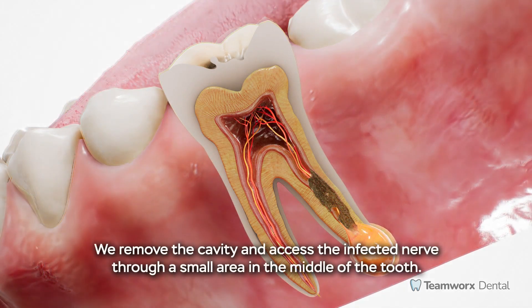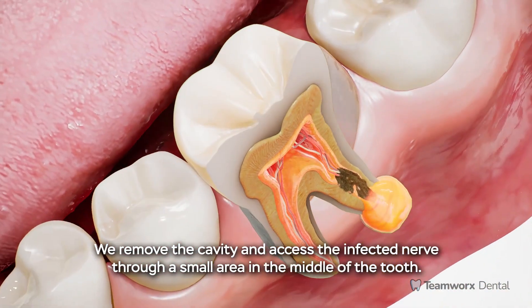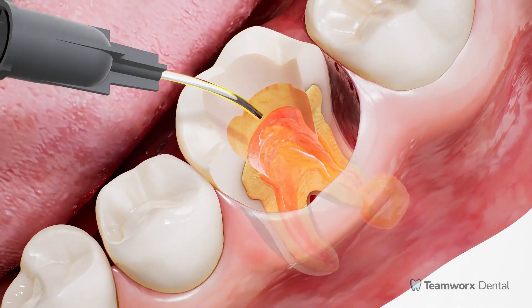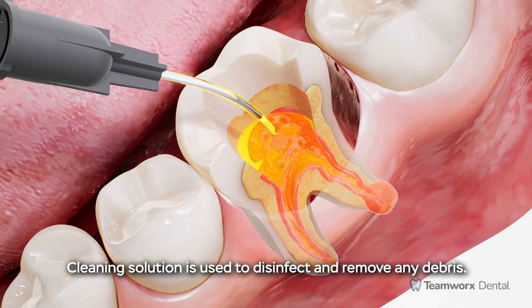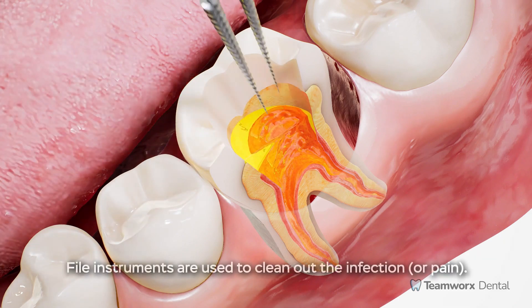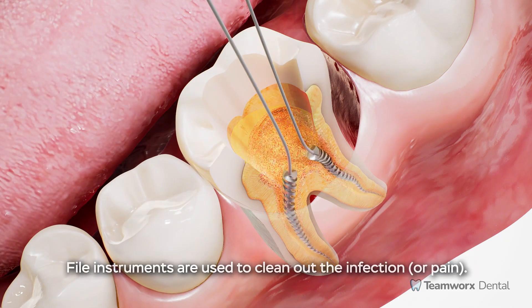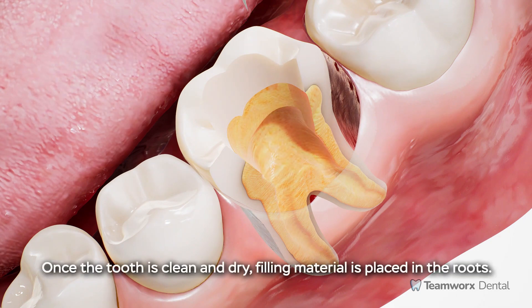We remove the cavity and access the infected nerve through a small area in the middle of the tooth. Cleaning solution is used to disinfect and remove any debris. File instruments are used to clean out the infection or pain.